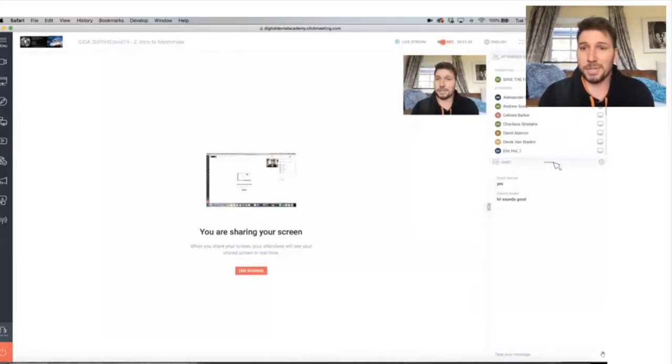Where I learned Meshmixer was just fiddling around a few years ago, and going from there, looking at some of the things that people like August Oliveira were doing, who is also going to be doing a lecture for us, Christian Breens, people like that, some of the amazing things that they've done, and I pretty much use it on a daily basis now. There's some software that will do some of the functions that Meshmixer does, but to be honest with you, once you've got used to Meshmixer, it's so quick and easy to perform very simple functions like cleaning up a model or producing a model that for me, it makes it invaluable. And the best thing of all, it's free.